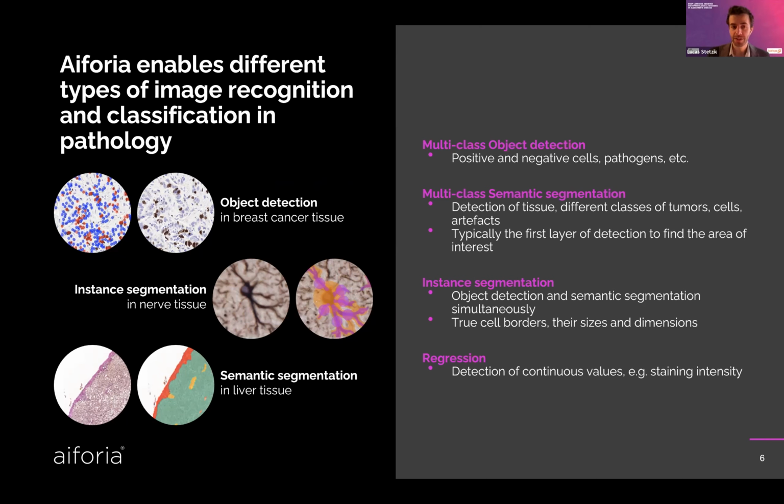And what that allows you to do is get the morphological patterns or morphological features of that cell, even if there's another cell right next to it. Because that first step is object detection, it will identify which portions of the image belong to that particular object, and then it'll segment those. So even if they are next to each other, even if you have processes that are overlapping, it really is able to sort of disentangle those things in a way that is honestly pretty impressive.